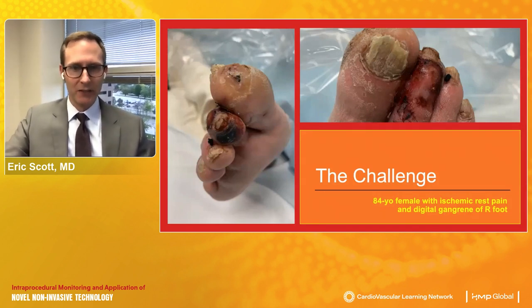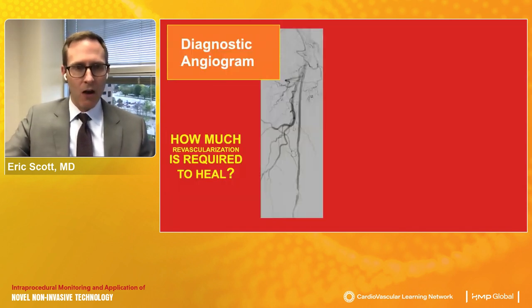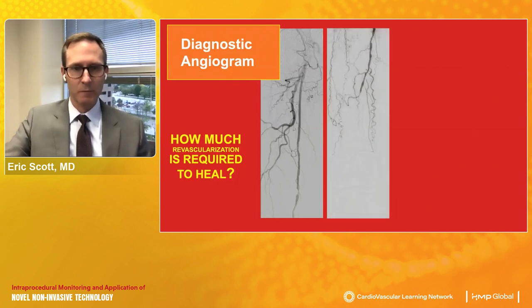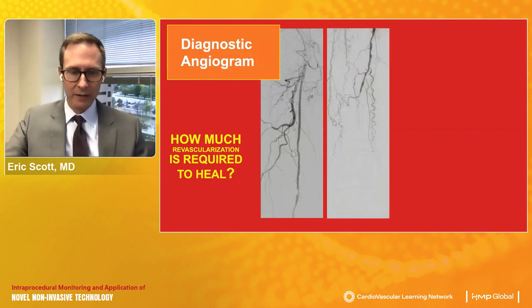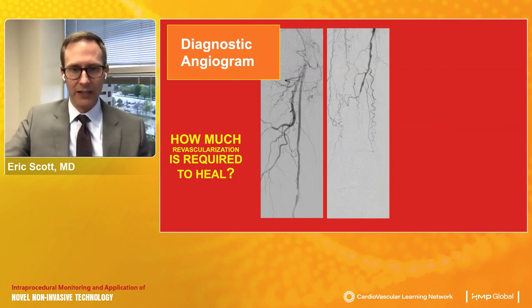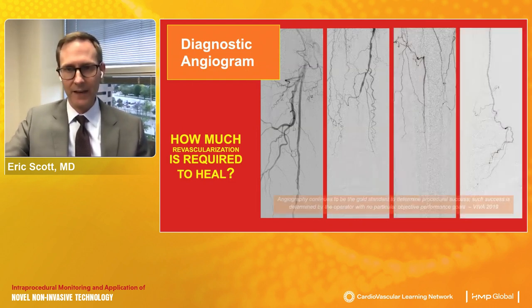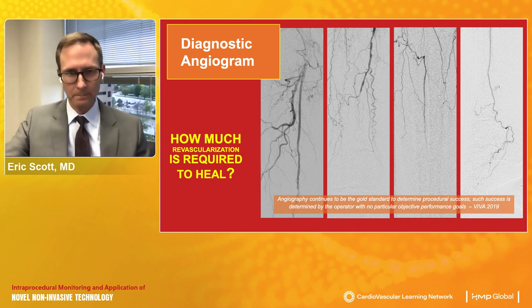I point to this particular case. This was an 84-year-old patient of mine recently who presented with ischemic rest pain and early digital gangrene of the right second toe. And on her diagnostic angiogram, there was no aortoiliac disease, but on the left, you can see a high-grade mid to distal SFA stenosis, more distally an occlusion at the adductor canal with complete occlusion of the popliteal artery, and only single vessel runoff in the calf via the peroneal artery.